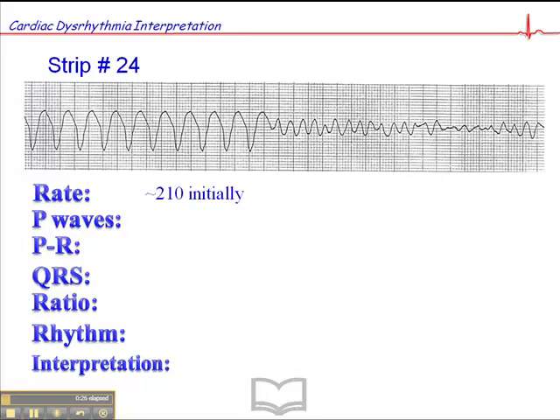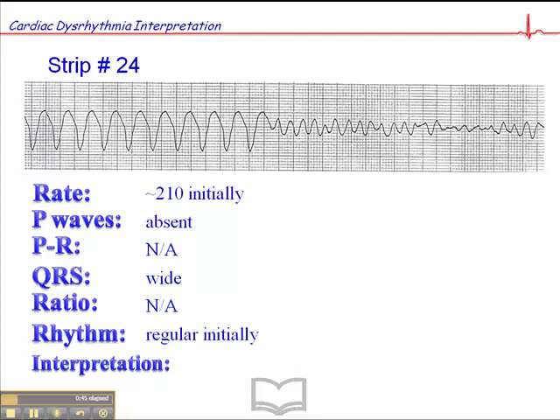It would be important to do a clinical assessment on this patient to see what their neurological and clinical status is during this kind of rhythm. P-waves are absent throughout. PR interval is not applicable. QRS is wide in the initial phase. The ratio is not applicable, and the rhythm initially is regular. So we have a wide complex tachycardia of 210 without discernible P-waves.